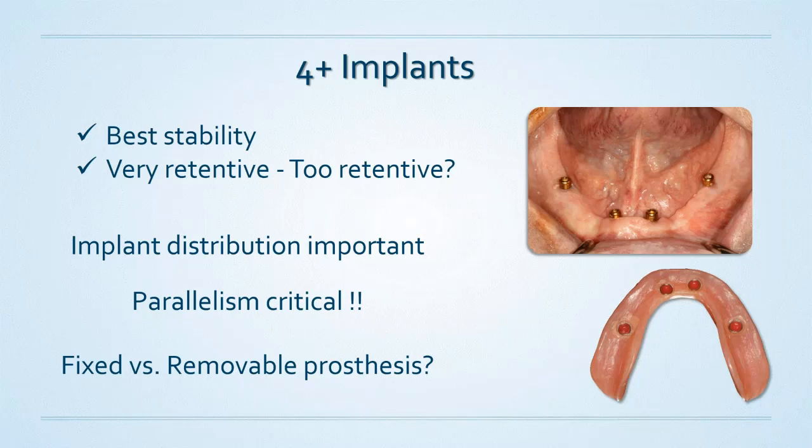So in my opinion, if I'm looking at an implant that costs approximately $200, $210, like a Legacy 2, Legacy 3 implant, the additional 2 implants is really not that much more expensive for my patients. If I figure out a way of pricing that, I find this incredibly beneficial to my patients. More on this a little bit later.